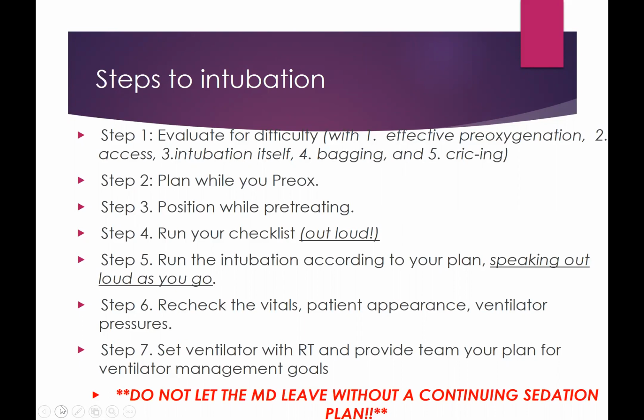Step 6, rechecking vitals, patient appearance, making sure that they're ventilating within the parameters that you expect. And step 7, getting the ventilator set up with respiratory therapy and really communicating the plan back to the rest of the team. And you'll see in big red capital letters, don't let them leave without a sedation plan.